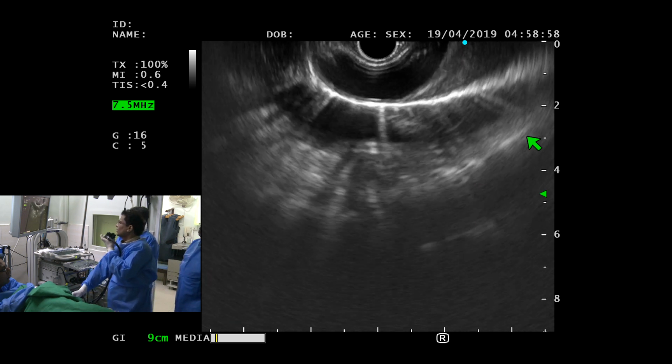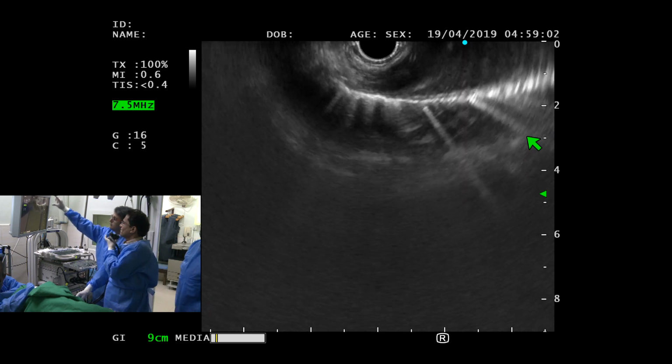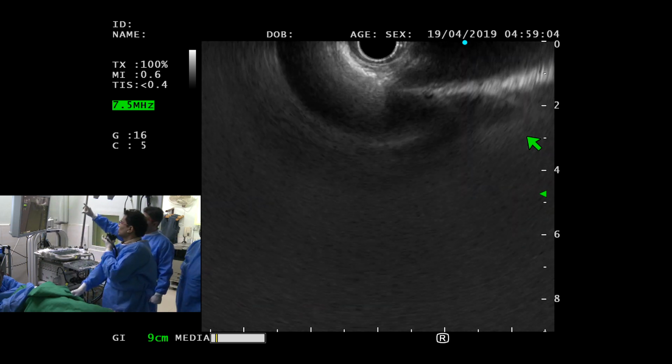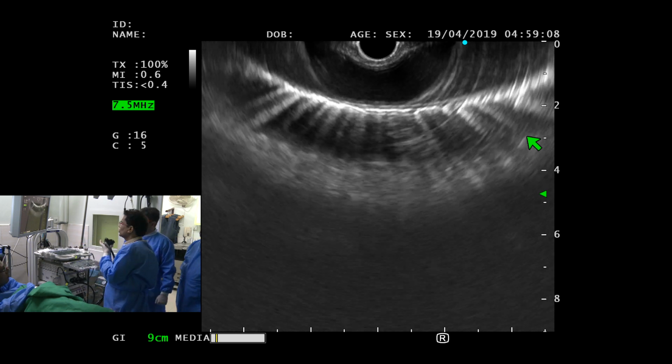Okay, there we are. So it's in the round position. How do we want the aorta? We want it in the sliding, right? Always remember, बच्चे को slide दिलवानी नहीं चलानी. Remember? So there it is.